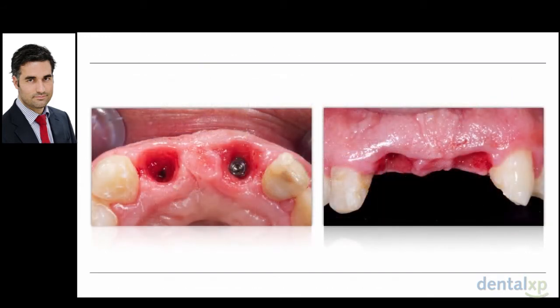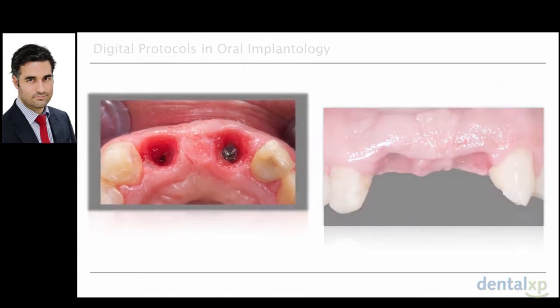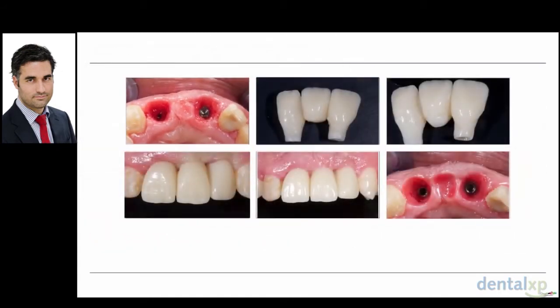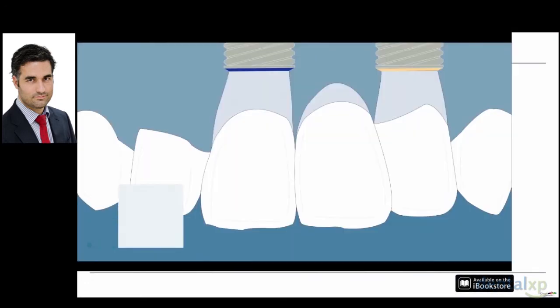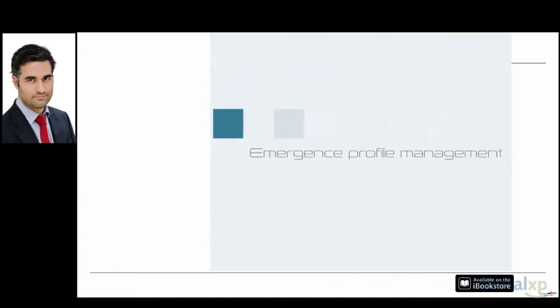Here we have the first emergence profile. It is not a good emergence profile, but we start changing our provisional. We put some acrylic in the dental office, and as you can see, the emergence profile starts changing. This is how I manage my provisionals.